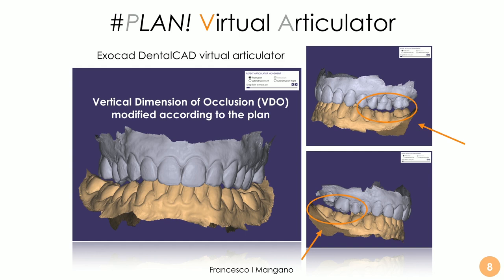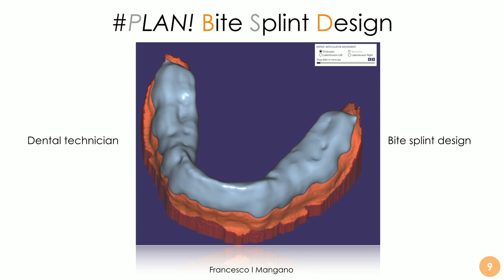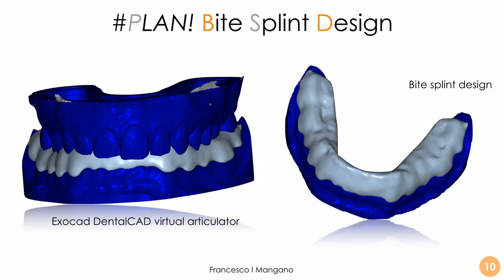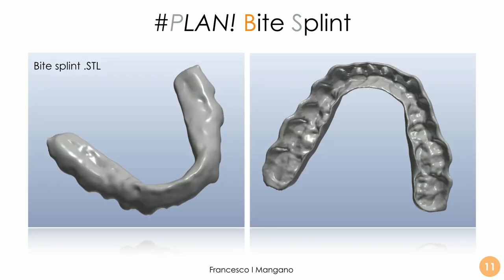In this simple case the dental technician designs a bite to relax the muscles, the masticatory system, and the jaw. The vertical dimension of occlusion is modified according to the plan, creating space for the bite. The bite splint is designed using the exocad software — a valuable tool also for bite splint design. Here is the bite splint in the exocad virtual articulator with the master model and antagonist. The STL files are checked from different perspectives before sending to the 3D printer.